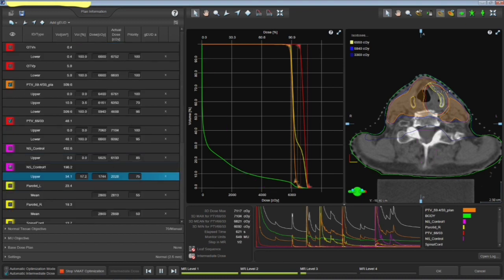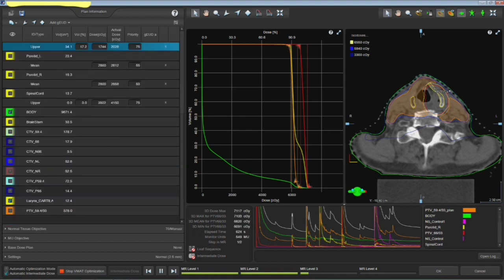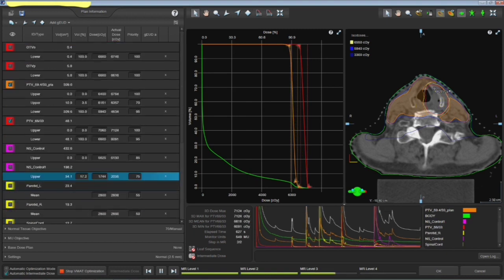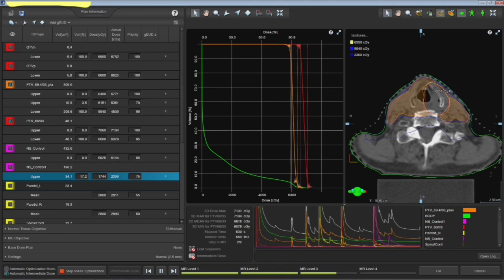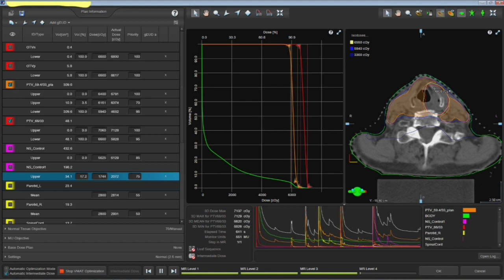Sometimes these cartilages are very important actually. It can even break if it is more than 70, 72 or something like that. That's what the clinicians say. So it's important actually, it depends on the clinical situation. The maximum dose, the global maximum dose, should not be on the cartilage. It totally depends on the clinician.